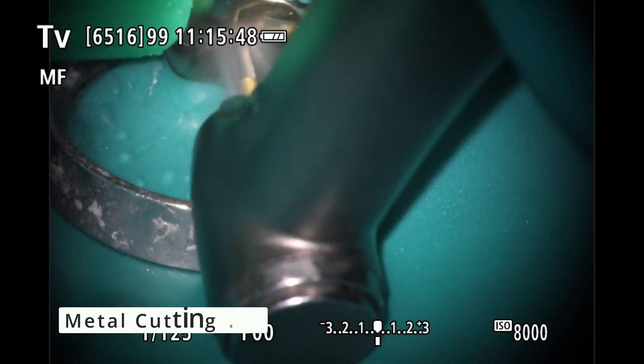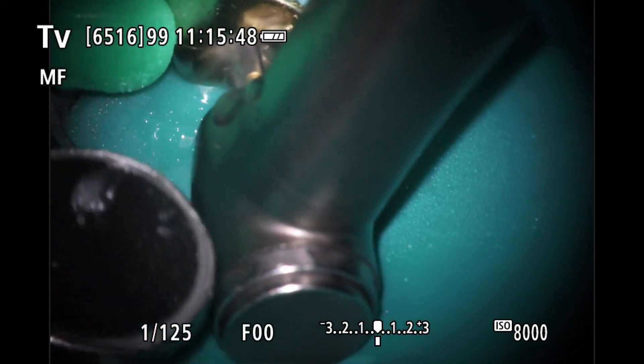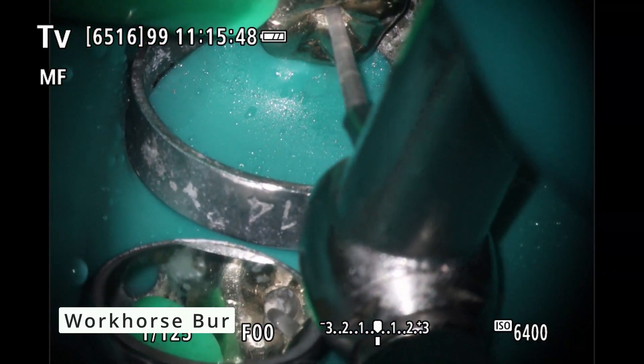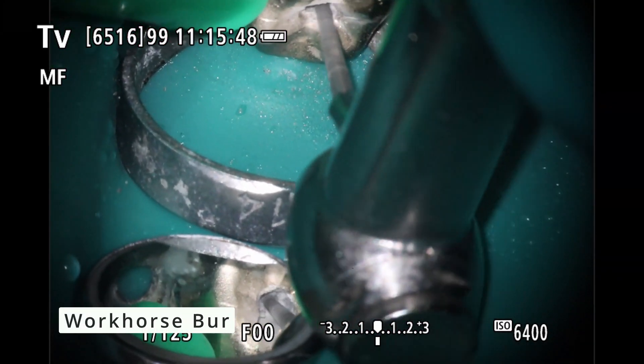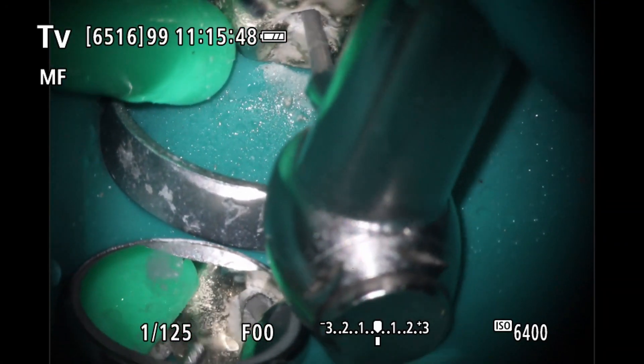I did zoom in pretty closely at the end. I do apologize — my settings were showing up for the first two minutes and I was able to get it changed after. But go ahead and pop through. The gold was very easy to drill through, and I just used the workhorse to kind of drop down into the actual pulp chamber itself.